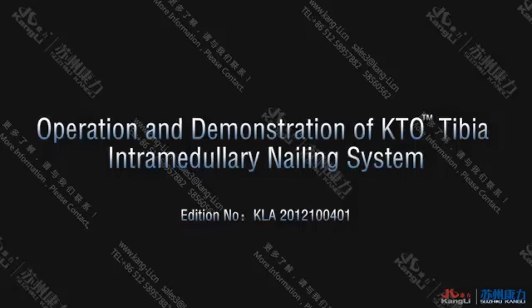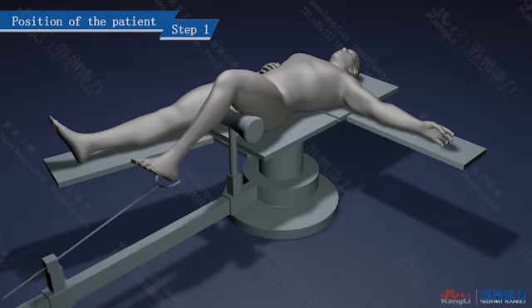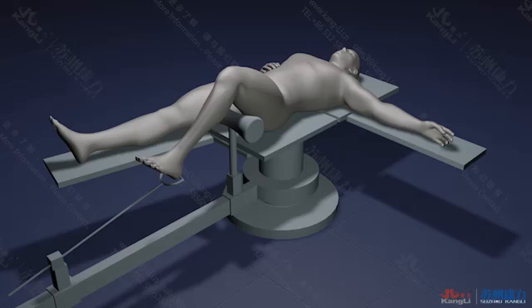Operation and demonstration of KTO Tibial Intramedullary nailing system. Step 1. Position of the patient. Place the patient on the fluoroscopic operation bed in supine position. The injured knee joint should flex at least 90 to 100 degrees for the insertion of the nail. Perform traction reduction for the fracture, and when satisfied, fix it on the orthopedic bed.